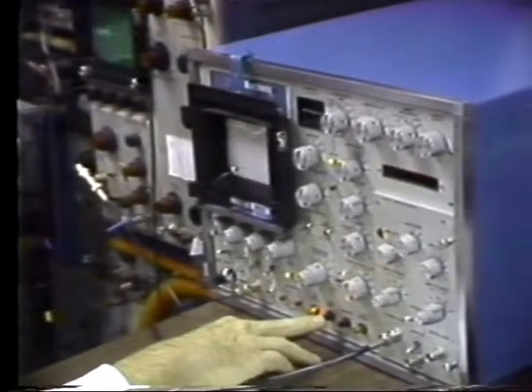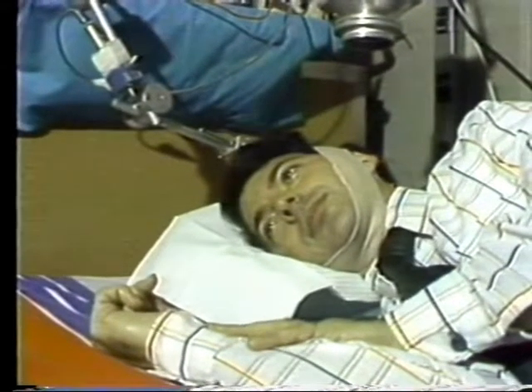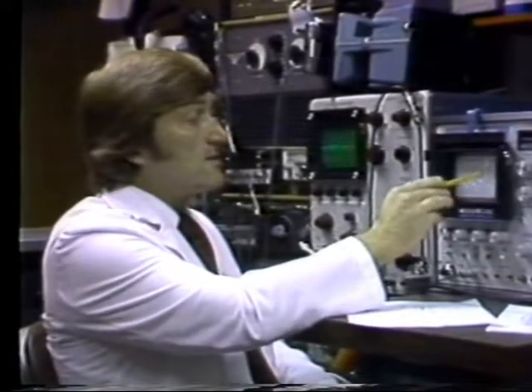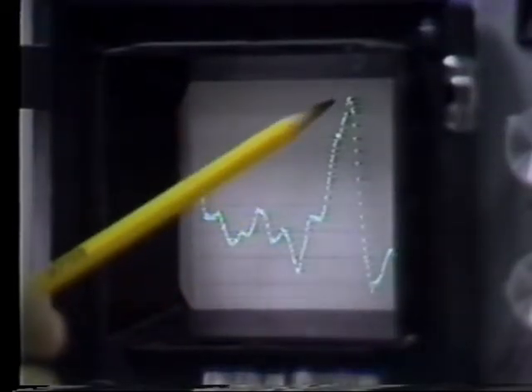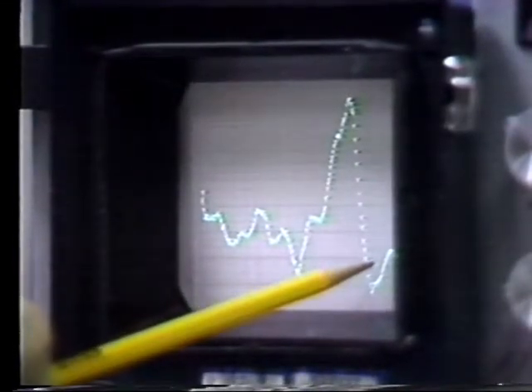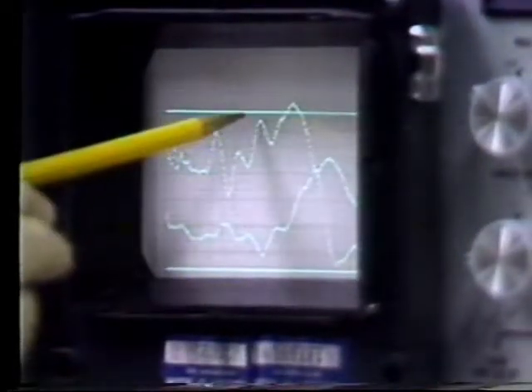Filtered brain signals, amplified at least 100,000 times, are fed into a computer in an adjoining room. Because stillness is so important, body movements are constantly monitored by an oscilloscope. When movement is detected, that portion of the test is thrown out. As the test progresses, a graph-like pattern of peaks and valleys emerges on the computer screen. Calculating the time delays between the audio clicks and these peaks, then comparing them to a so-called normal graph shows whatever hearing loss, if any, is present.